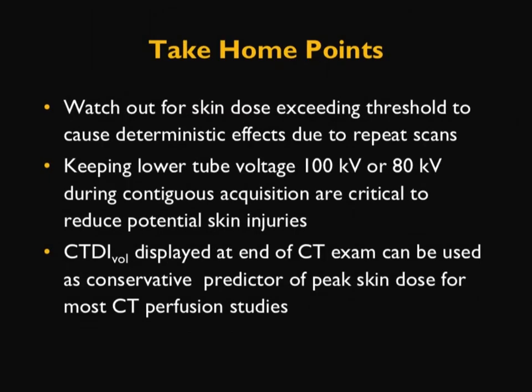So the take-home point is, one needs to watch out for skin dose exceeding the threshold to cause deterministic effects due to repeat scans. We can do a lot of measurements, but one is to keep the lower tube voltage. I'm going to repeat this. So the take-home points.